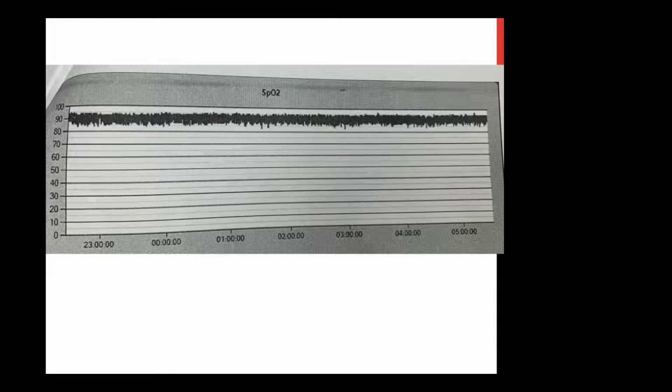So what do you think it is, though? It looks very uniform. Like Madhuri mentioned, it's going between 95 and 85, back to 95, back to 85, very uniform. I don't know if this is maybe a central apnea, just given the uniformity, but it's like the entire night.